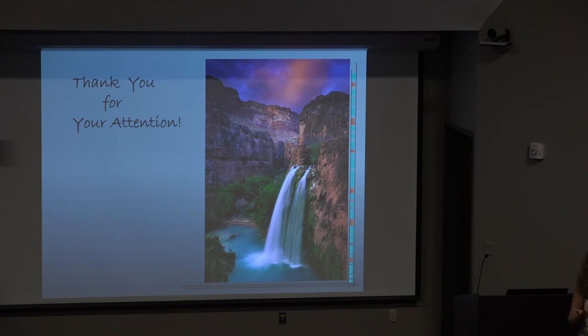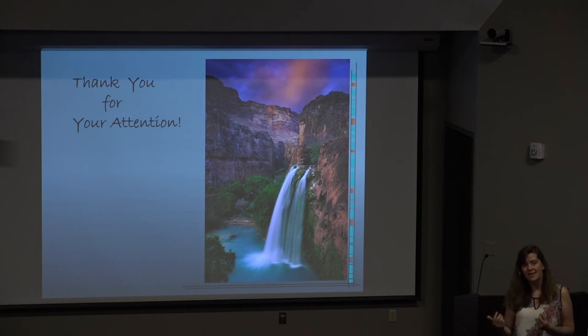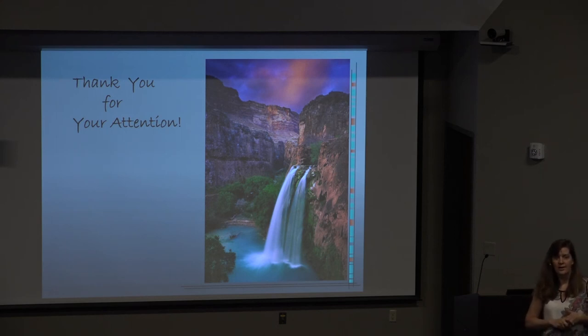And then the nodule size has to be 7 millimeters, right? I mean, I have several cases, and this is the thing. All those little papillary projections and nodules, they have time to grow, right? So you're probably not looking at a high-grade cancer, because those tend to be a lot more solid when they're small. You're looking at some kind of borderline or low-grade thing. So you have a little time, but you want to wait. So to answer your question about who should go to MR, in my opinion, if you ever see internal soft tissue, so irregular septations, papillary projections, any nodule, those should go to MR, because that's the group that has the malignancies in them.